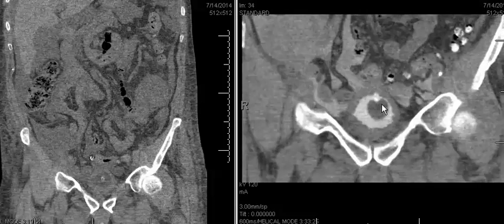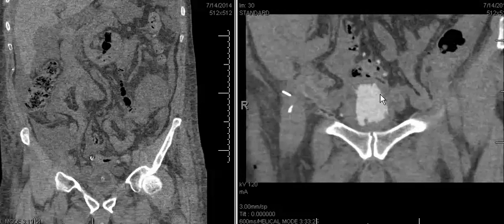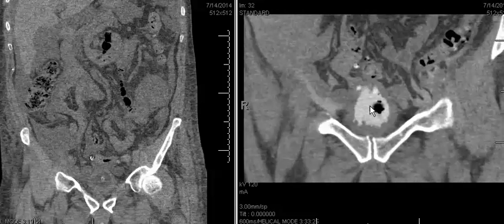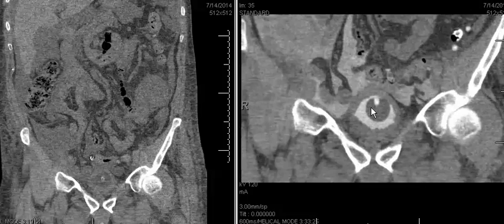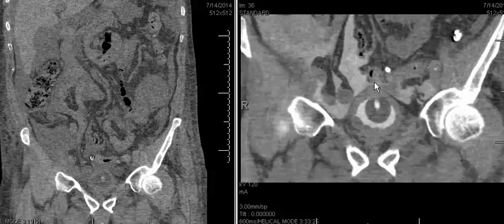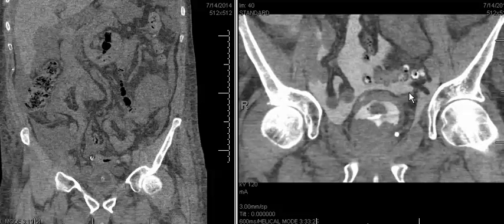Notice also that this bladder is very trabeculated with thickening of the bladder wall. These findings were again consistent with intraperitoneal bladder rupture, which did require surgery in this patient. The key to making the diagnosis of intraperitoneal bladder rupture is noticing contrast extravasation from the bladder into the peritoneal spaces, along the pericolic gutters and also outlining loops of bowel within the abdomen.